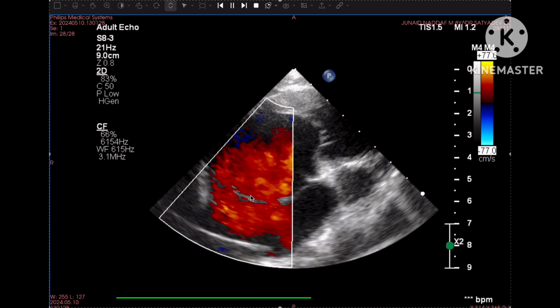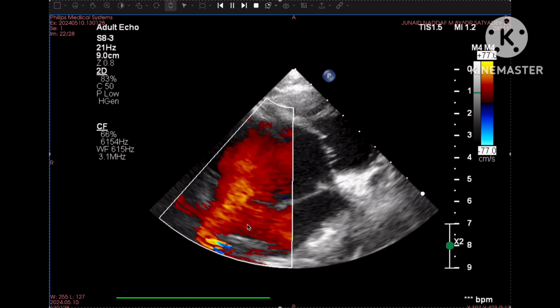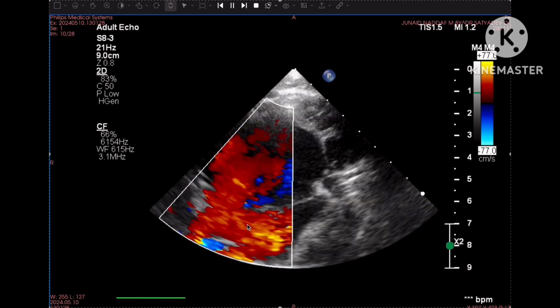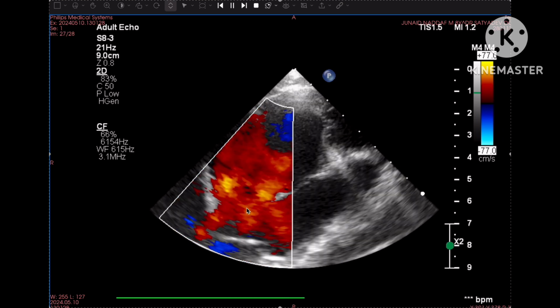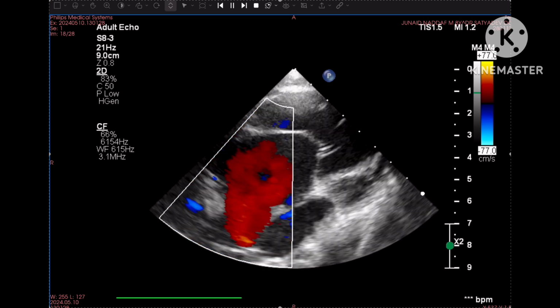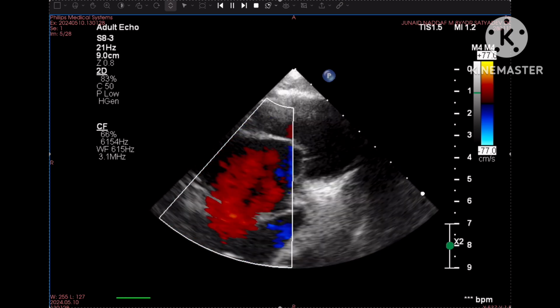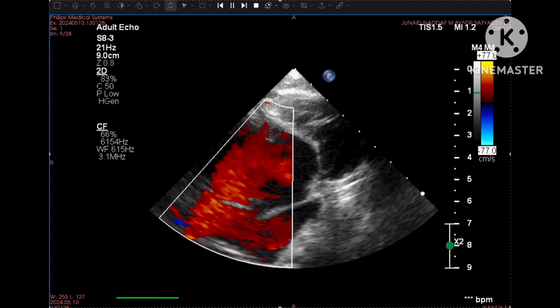This is the typical view in which books normally describe how to find sinus venosus ASD. This view is also obtained through the subcostal window. That is a little bit coronal view. Obviously all the views are between the sagittal and coronal plane.